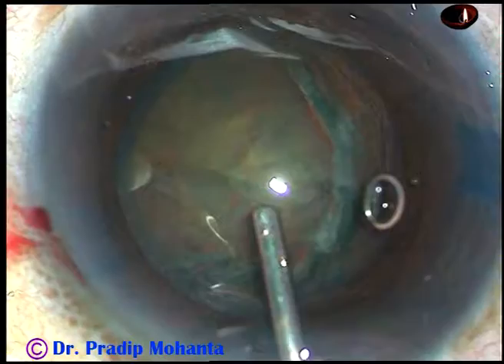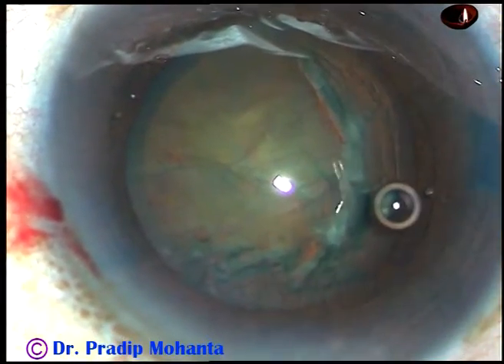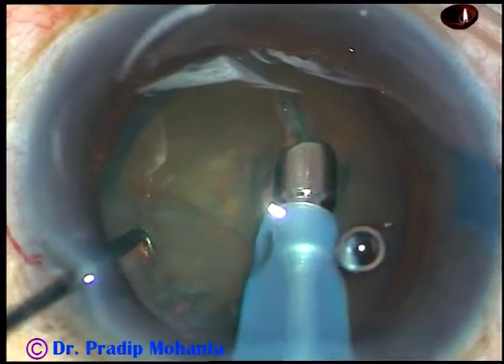HPMC is injected again and now is the time to introduce the tip of the phaco handpiece. This is nuclear sclerosis grade 2. It is not easy to hold such nuclei. So see what is the way.